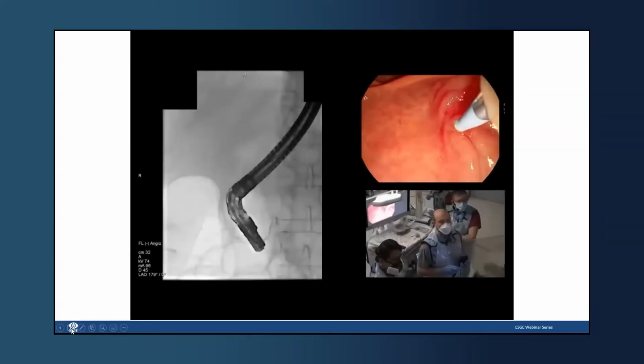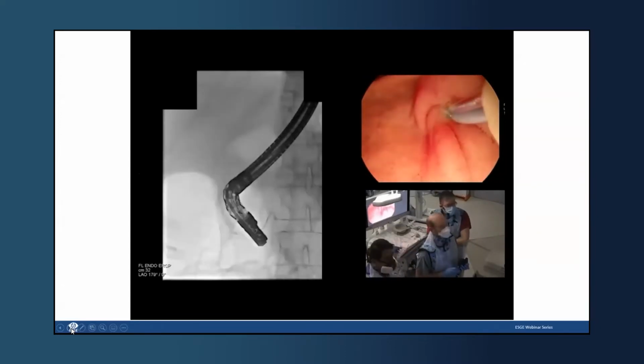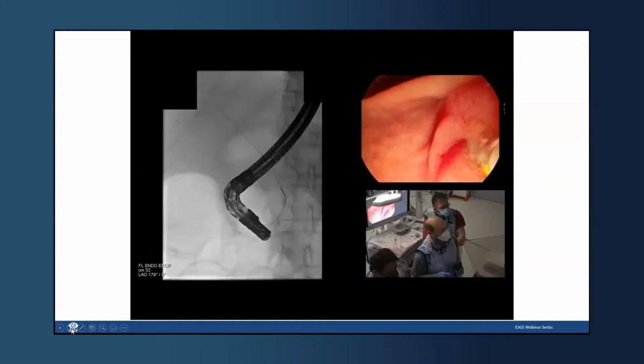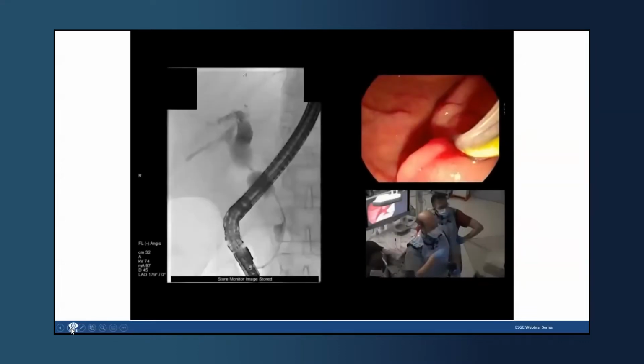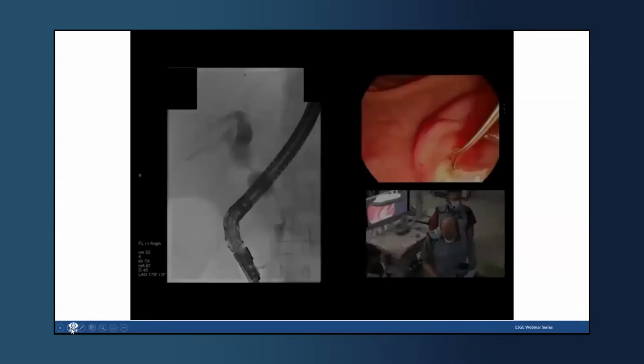Another little go, see if we can skip up under there. That looks very good. Nice and gentle, that's good. That's very nice. Okay, so it's quite an angulated bile duct. I'm sure that's related to the mass, isn't it? It's a very shouldered stricture, isn't it?